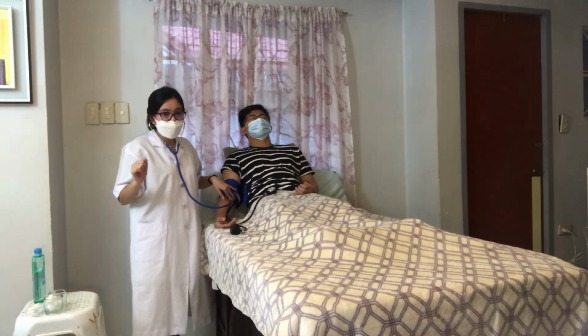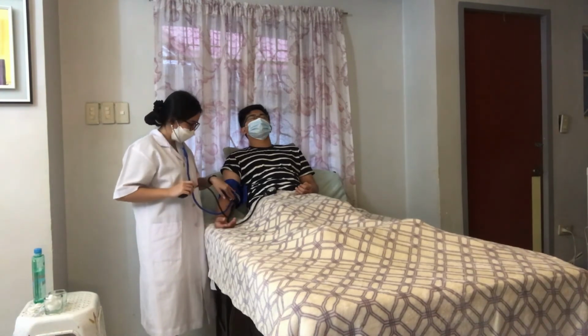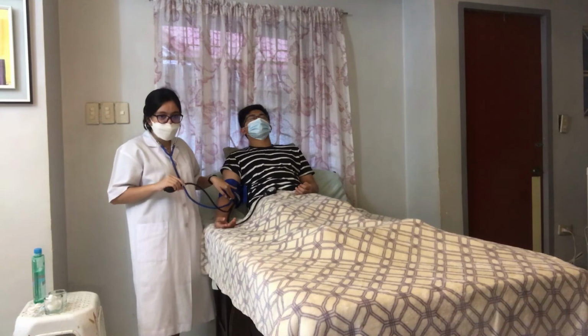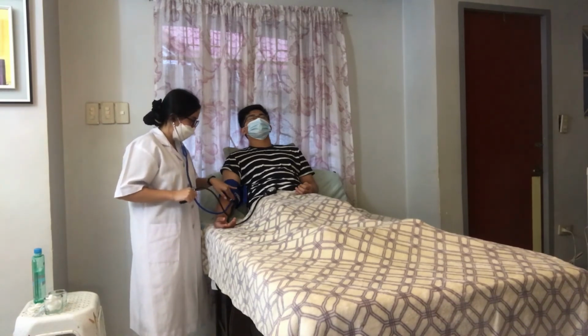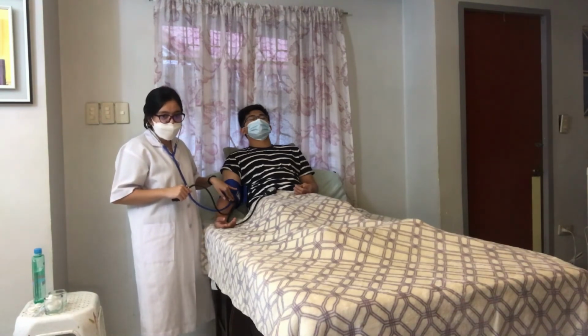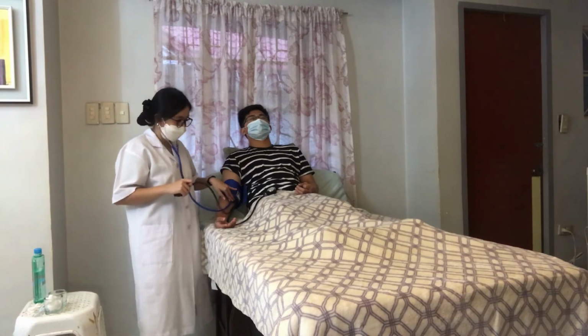After that, we are going to close the valve of the pressure bulb clockwise until it is tight. Now after that, we are going to quickly inflate the cuff until the last sound, then add 30 mmHg. And then after that, we are going to slowly release and open the pressure valve and allow the manometer gauge to fall at a rate of 2 to 3 mmHg per second.